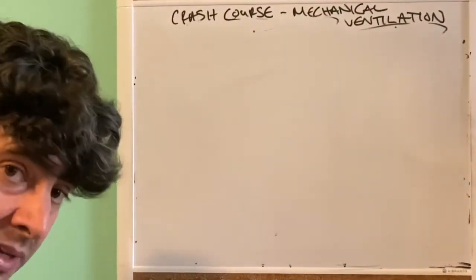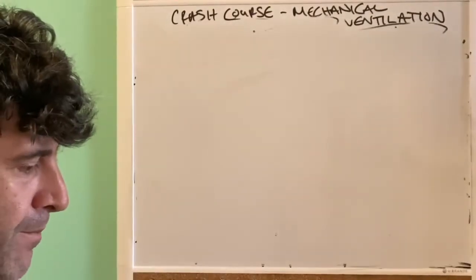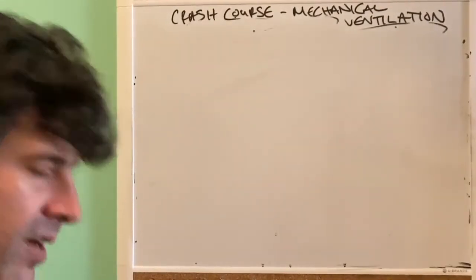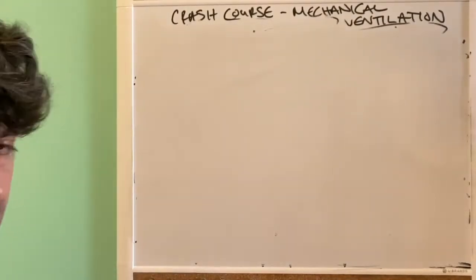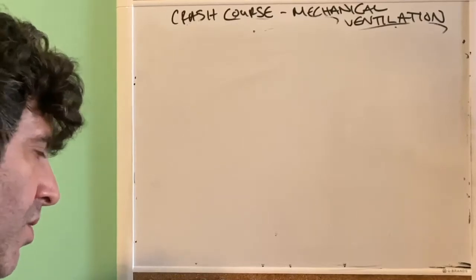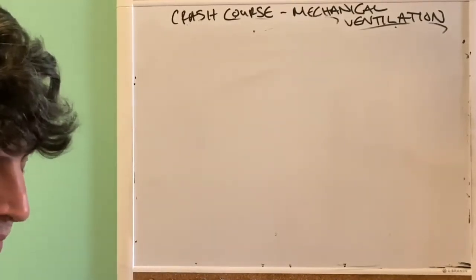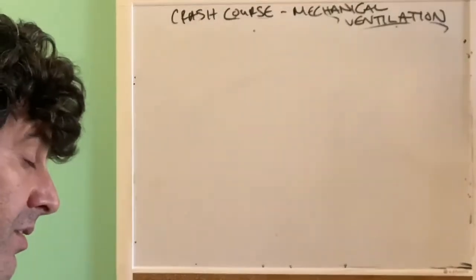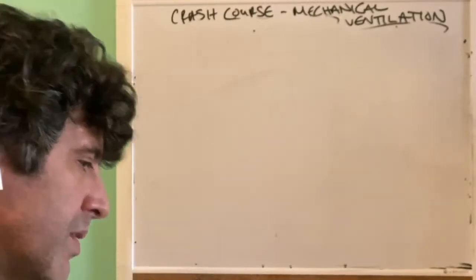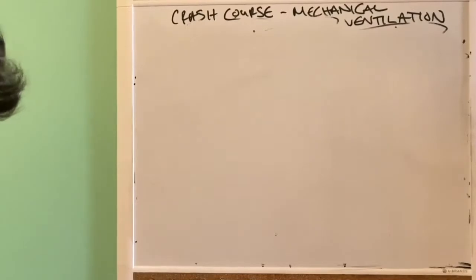And this is extremely, extremely important, all right? Just always remember that there are always 2 ventilators, all right? The fancy one that we set, and then the one deep in the patient's mind. And that one is always much more sophisticated than the one we manipulate with knobs, all right? And so one question that you always want to ask is, is the patient's respiratory drive intact? Is the patient's mental ventilator working? Why might it not be working?